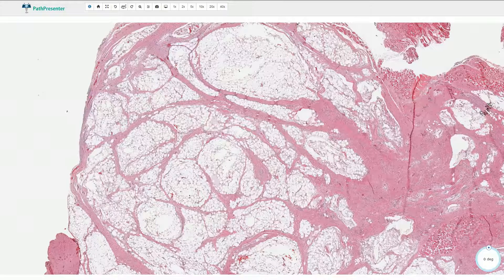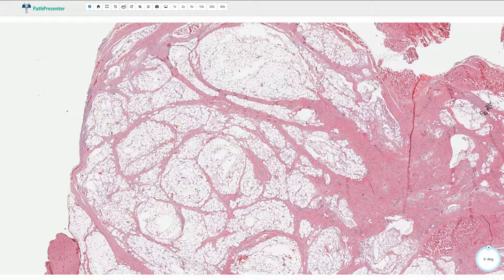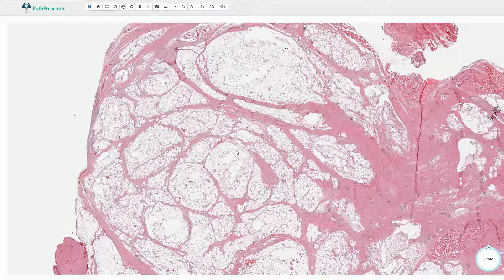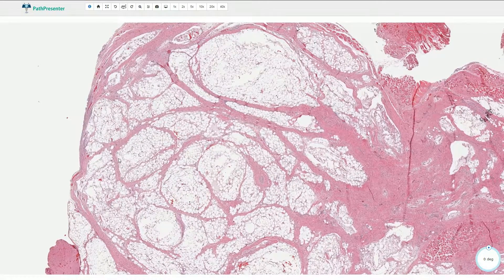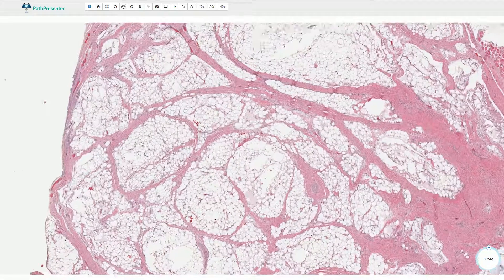Lipoblastoma is a benign neoplasm of embryonic white fat tissue. It typically affects very small children, usually younger than three years. It is most commonly found in the subcutaneous tissue of the trunk or extremities.